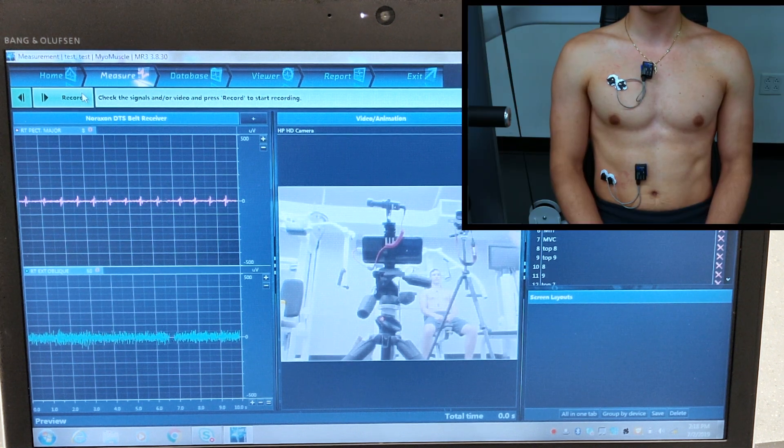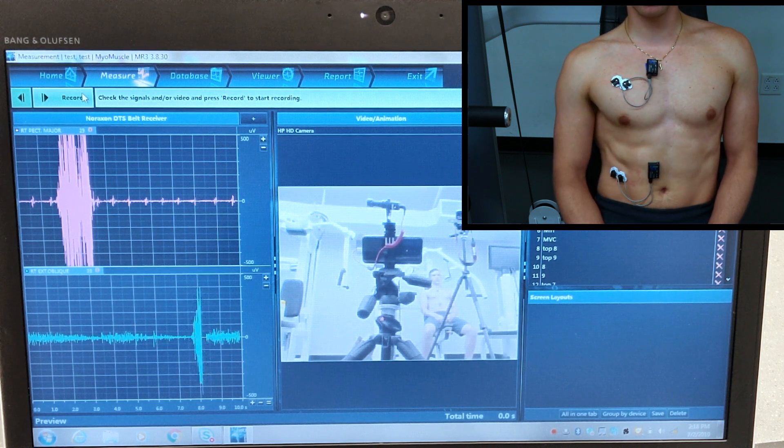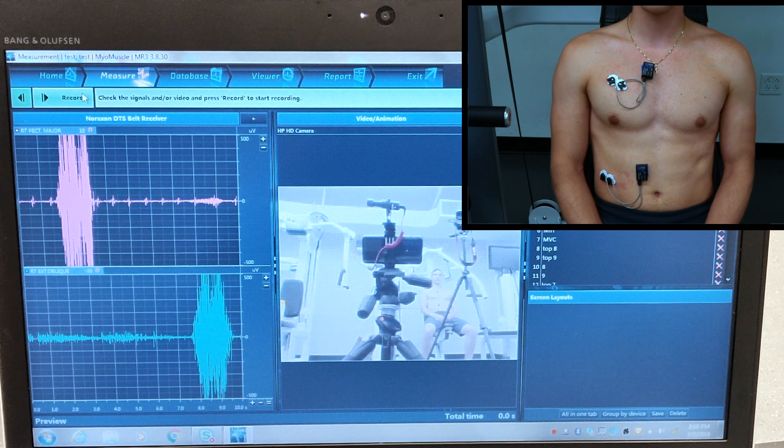Now our subject is going to squeeze his pec — as you can see, that's our top left EMG signal — and squeeze his oblique — that's our bottom left EMG signal.